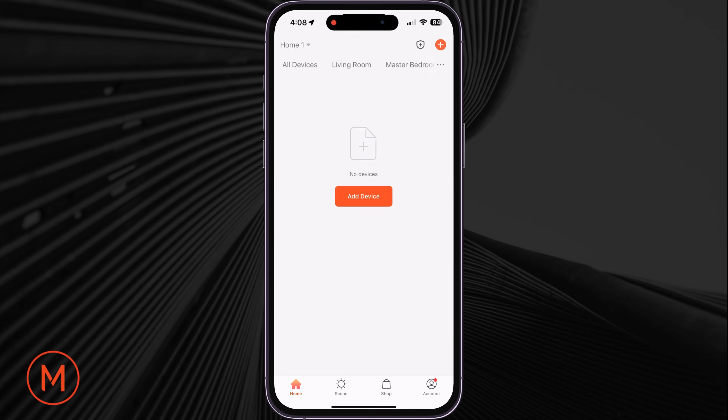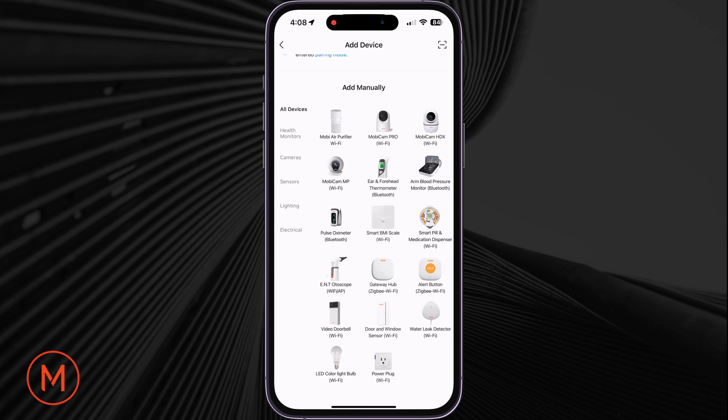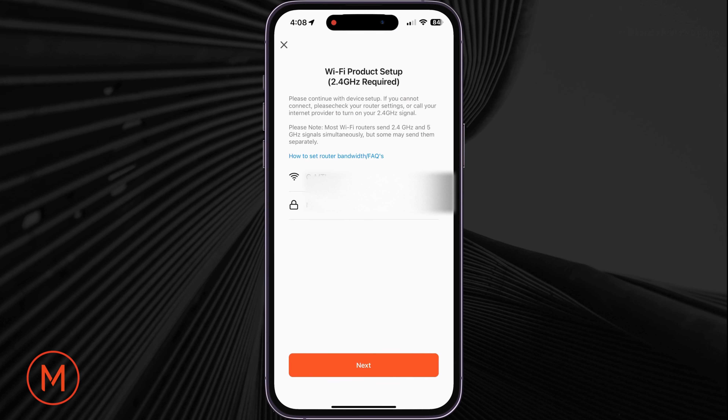On the main screen of the app, tap on Add Device. Under Add Manually, look and tap on the smart pill and medication dispenser. In Wi-Fi product setup, please enter both the username and password associated to your 2.4 GHz Wi-Fi connection.